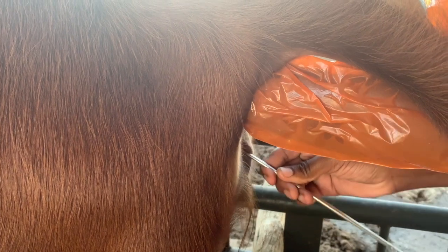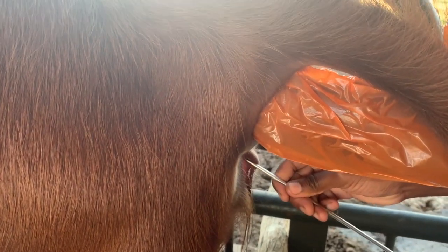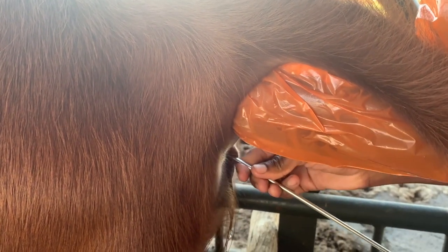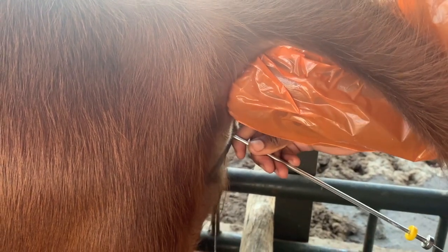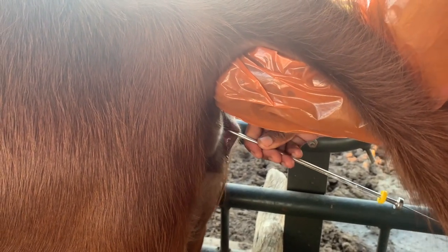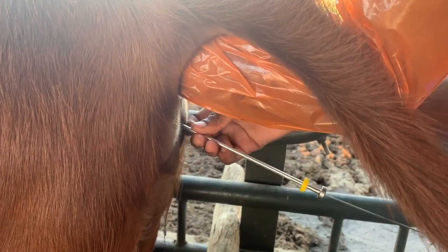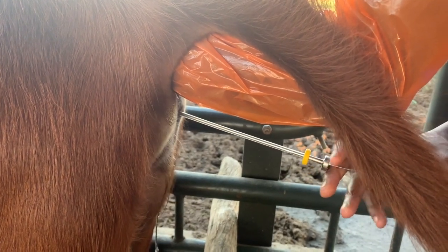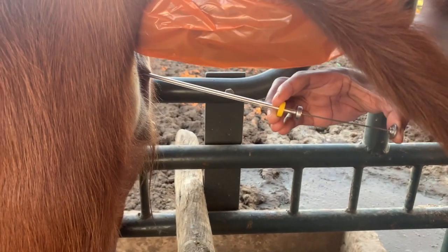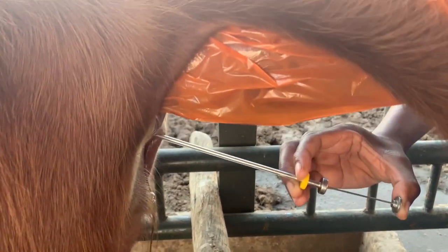You are now looking for the body of the uterus, which is just after the third ring of the cervix, and where you want to deposit the semen. To check if your gun is in the uterus, use your index finger of your gloved hand to feel for the tip of the AI gun. Even if the heifer moves, make sure you keep the gun in position. Once you are in the uterus the gun should be very stable — you can let go of it and it will not fall down. When you are sure it is in the correct place, slowly deposit the semen by pushing in the end of the AI gun, which should take around five seconds. Even if the heifer moves, keep depositing slowly.